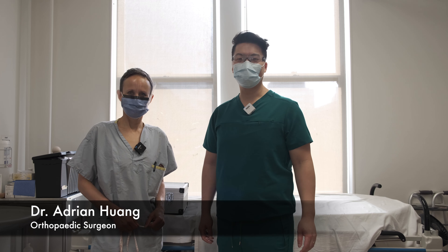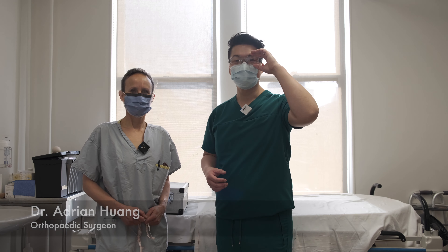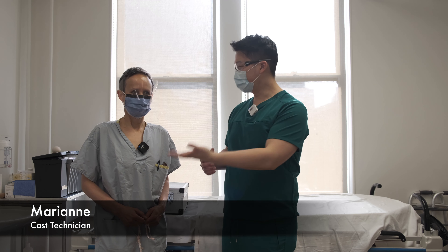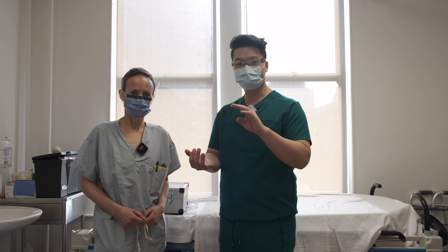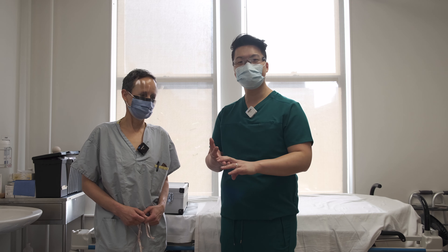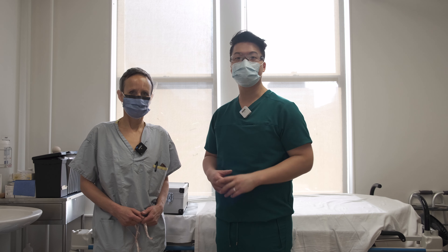Hey everyone, my name is Dr. Adrian Huang and I'm an orthopedic surgeon specializing in shoulder, elbow, hand and wrist pathology. I am here today with our amazing cast technician, Marianne. She's in charge of all of our splints, our slings and our casts. She is going to show us today how to properly fit your shoulder abduction sling.